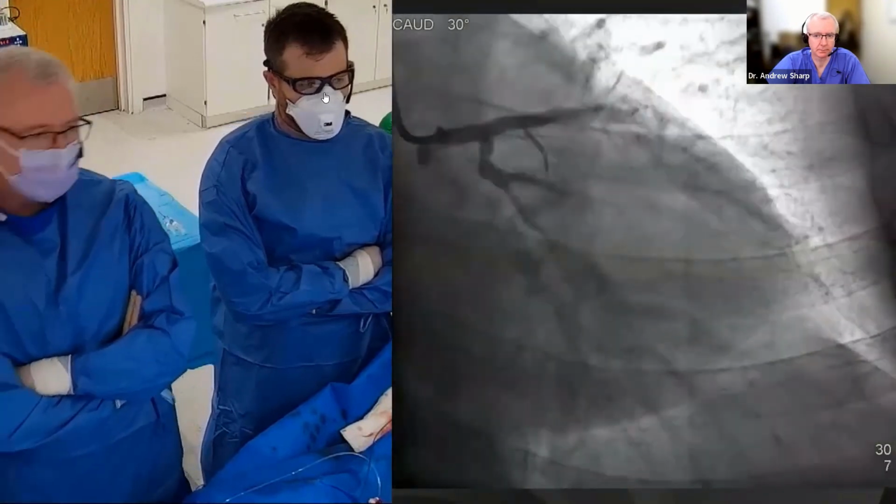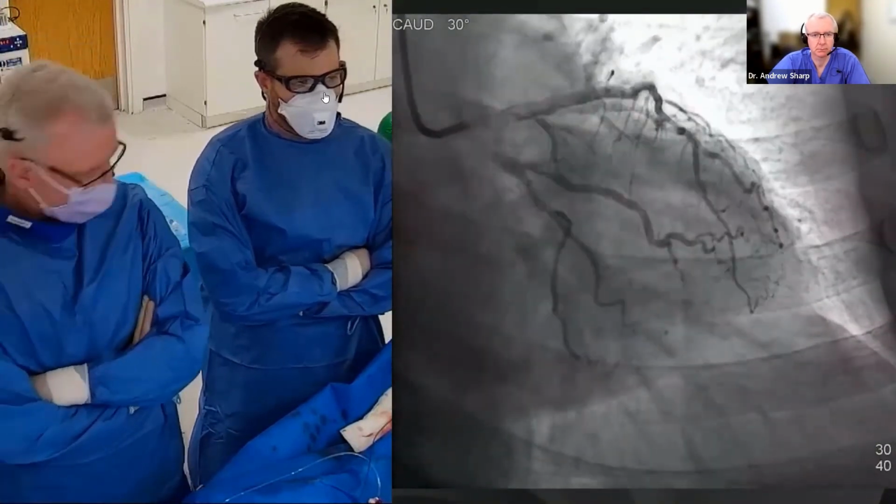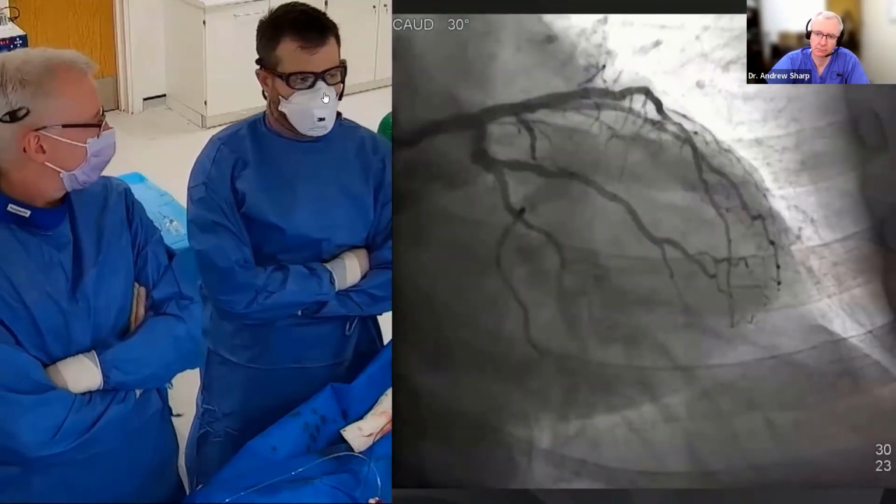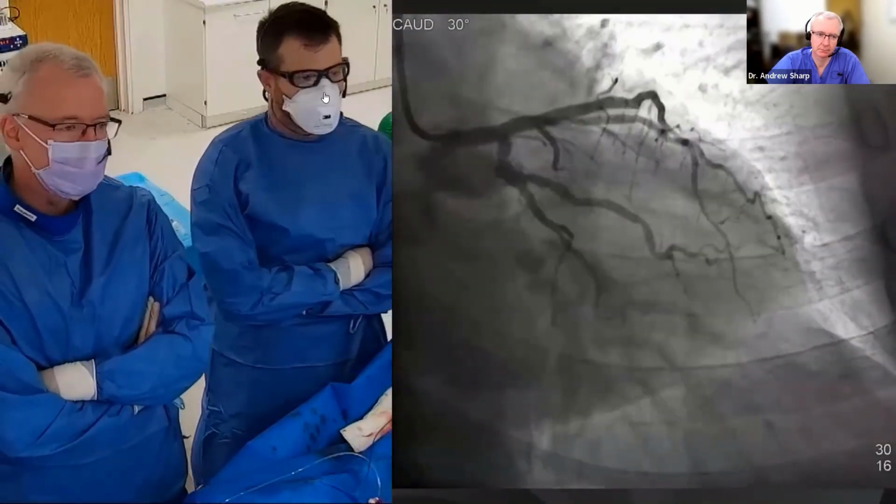So how long have we been operating for? 35 minutes. And we've done 4 IVUS runs, whatever we've done. So this business of you've no time to do IVUS, I think we've just demonstrated that that's not the case.